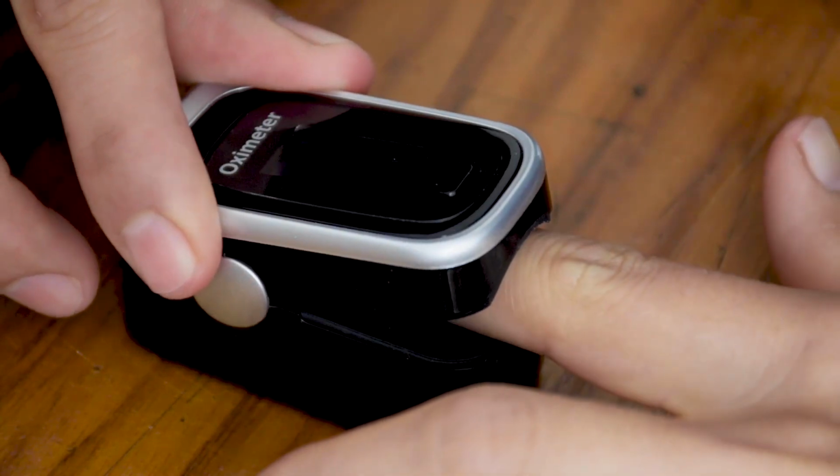So now I will explain the most commonly used wearable devices in detail. It will be the pulse oximeter. A pulse oximeter is a medical device used to measure two vital parameters, oxygen saturation level and pulse rate. It is a non-invasive and portable device commonly used in healthcare settings, home care and during physical activities.